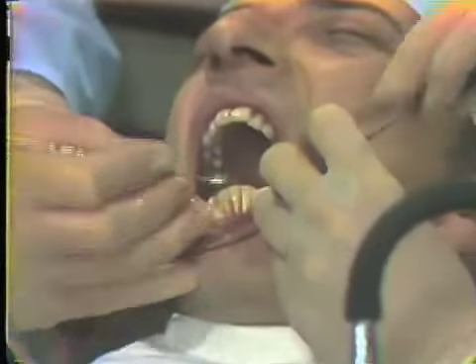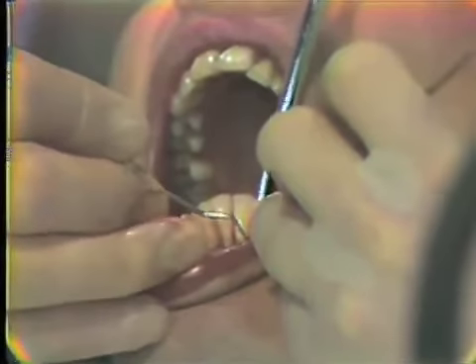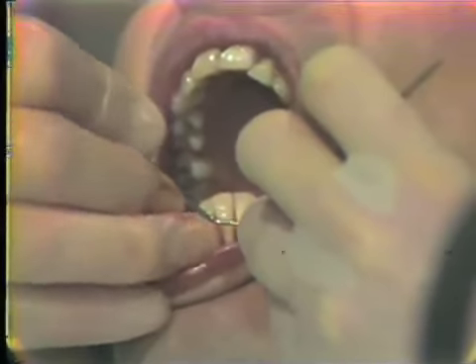You noted then that she has placed the retractor underneath the flap and is resting the metal retractor on the alveolar bone.